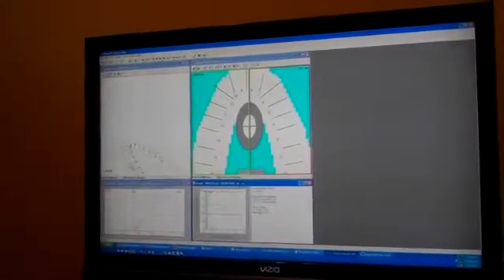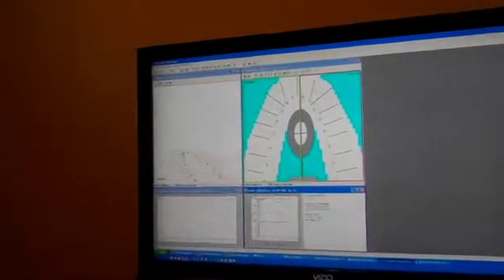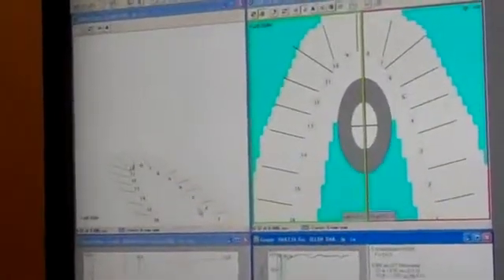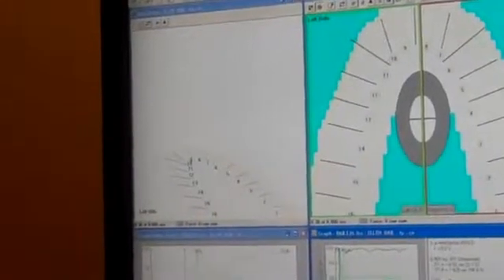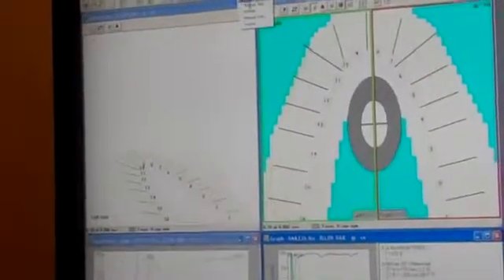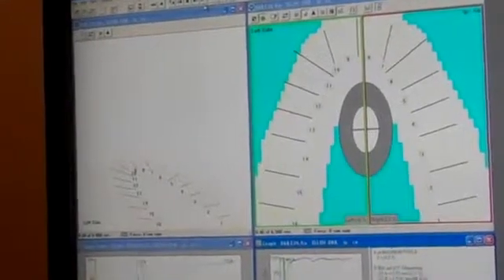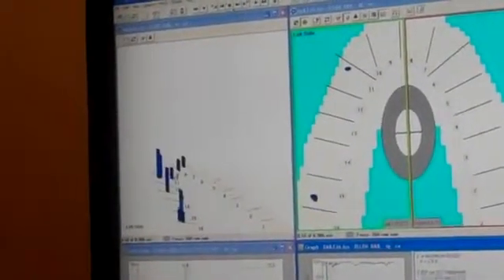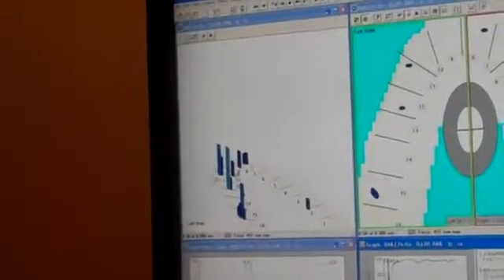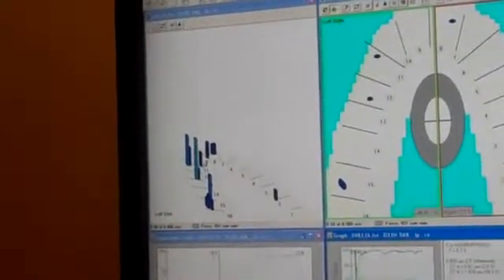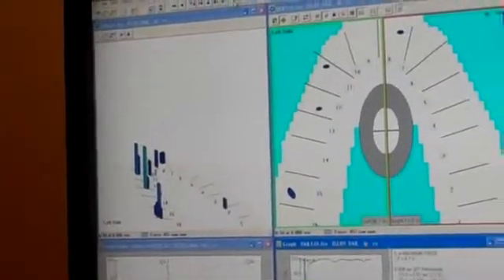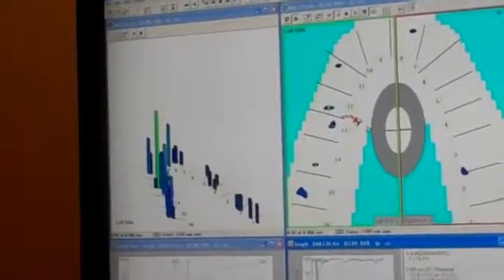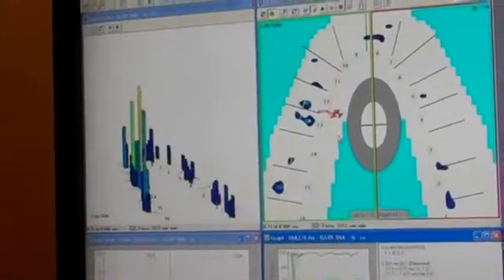Things in blue are normal healthy forces. The rest of the test reads like a traffic light. Green is acceptable, then we can have forces in yellow which is moderate, and then red is really bad or poor for the particular situation. When we have forces of less than 10% that start showing up here, when the forces get more than 10%, we actually get a hurricane tracker to help us trace exactly where the force is located.